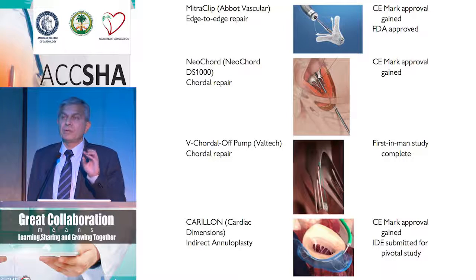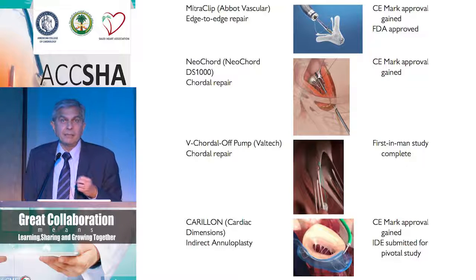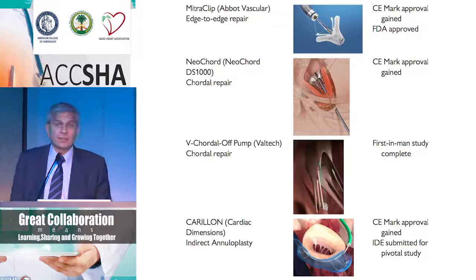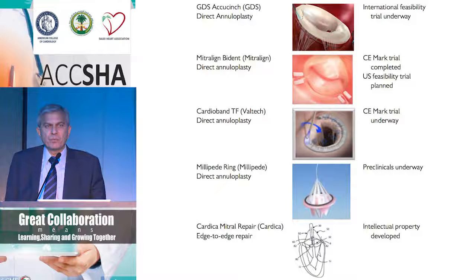Obviously, the mitral valve clip may not be here to stay over the foreseeable, or at least the long-term future. What are other daring percutaneous technologies? There are a zillion of them. In fact, it is much more complex than the story that you've heard with TAVI.